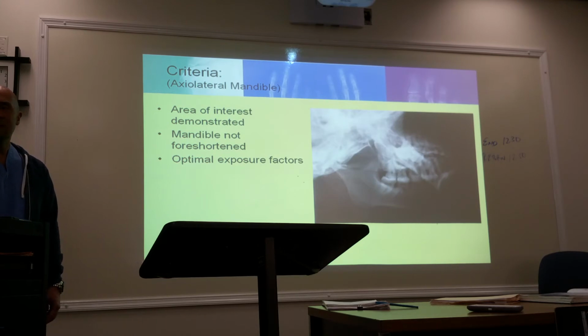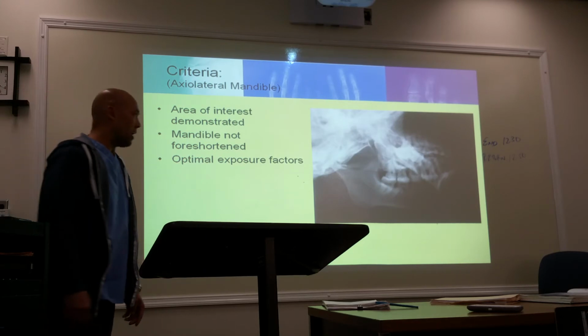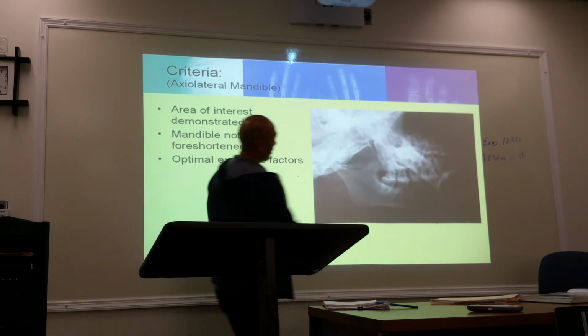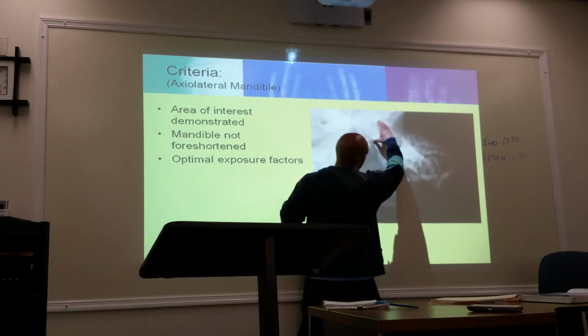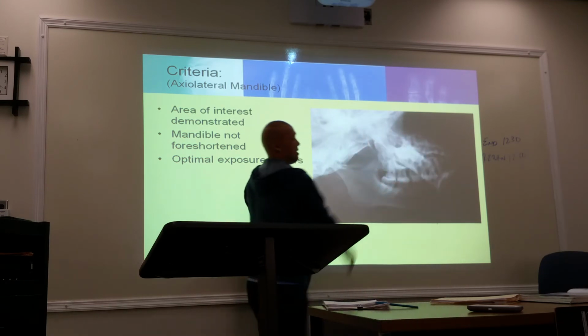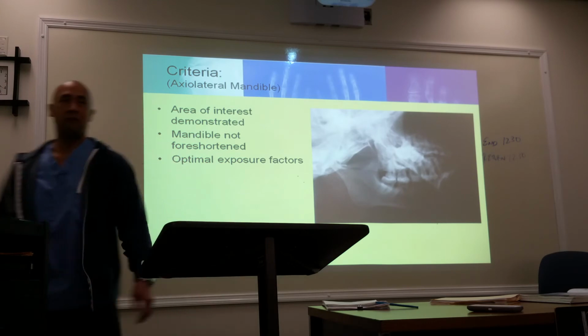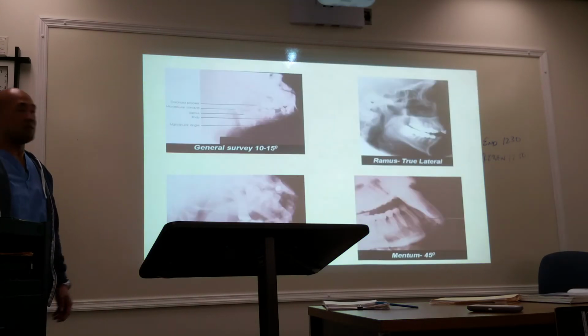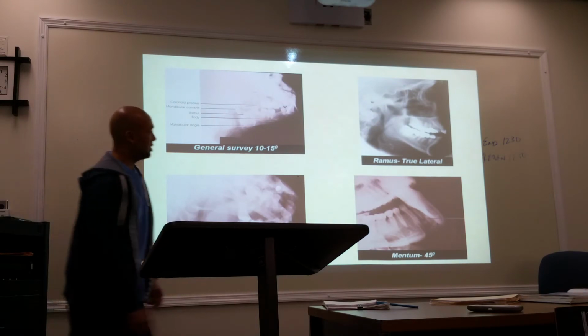Okay. What does this look like to you? Just by the way, it's not double exposed because it's going like this. It looks like it's double exposed, but it's going like this. Okay. Is this a 30 degree or 45 degree? 45? I'm gonna say it's 30. I'm gonna say it's this. 30? Yeah, this is too steep.